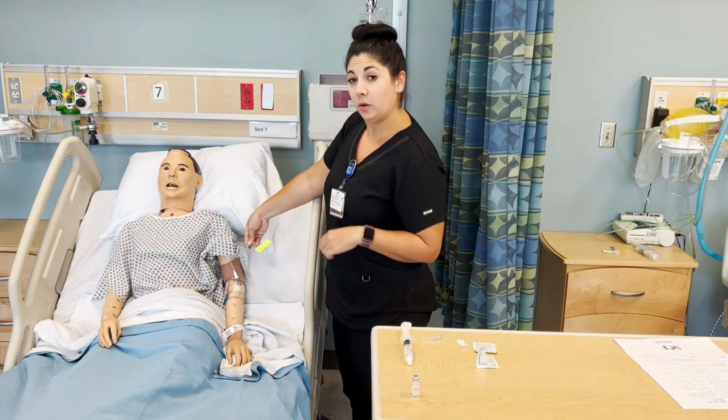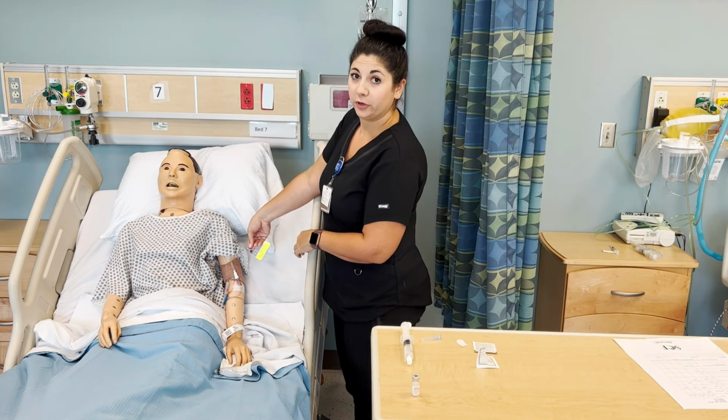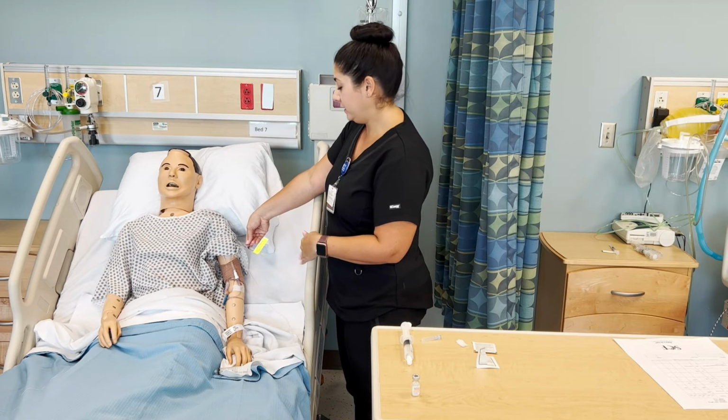You'll be pinching the whole time you're giving this medication. So you go ahead and give the allotted med amount over your 15 seconds, wait 15 seconds, and then continue to give the medication over the allotted time.